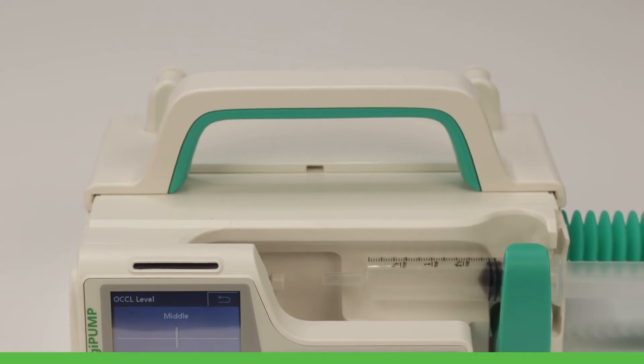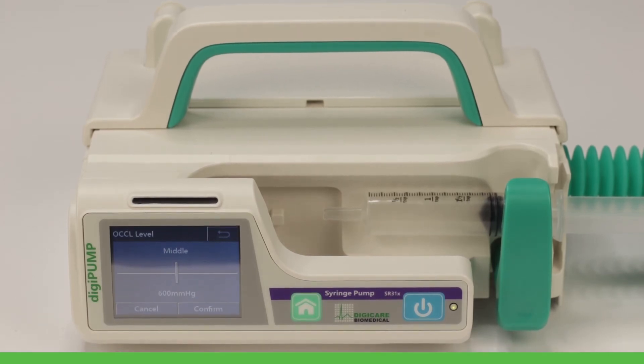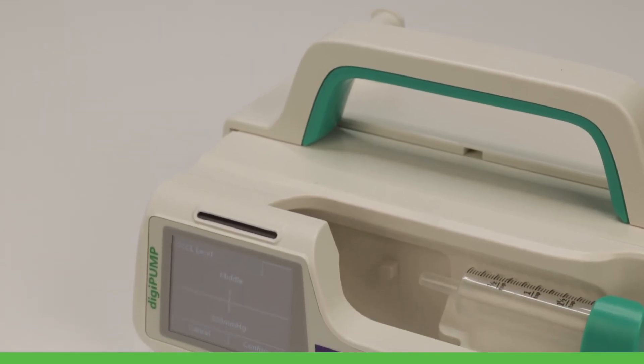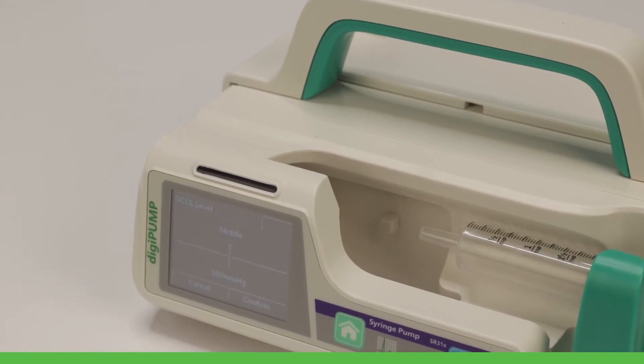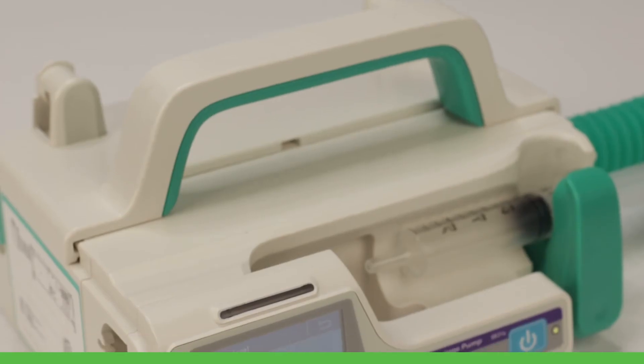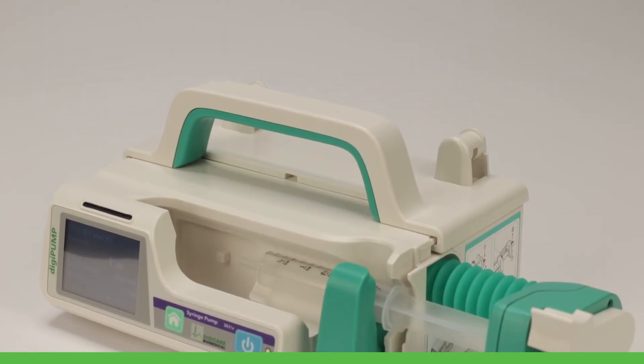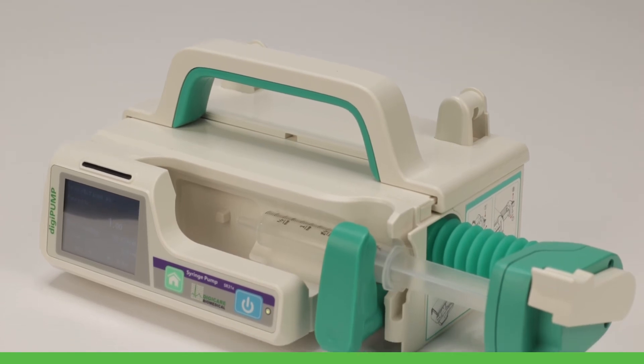To ensure safety and accuracy, the DigiPump SR31X occlusion levels can be customized based on any patient's therapy, along with an infusion setting range starting at 0.1 to 300 milliliters an hour all the way up to 0.1 to 2,000 milliliters an hour, making this device extremely versatile.